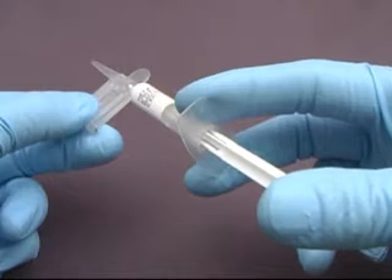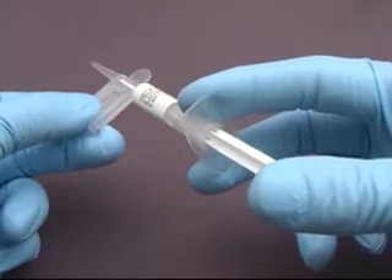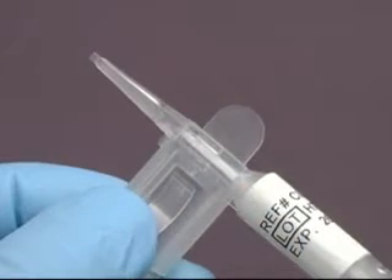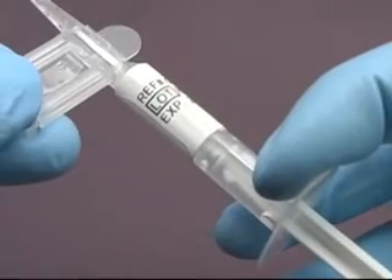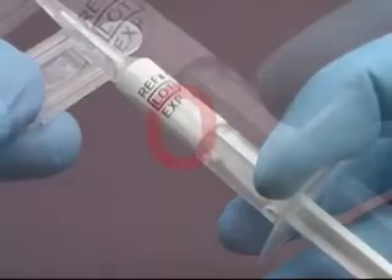Now slowly advance the plunger, which will move the CrystalLens forward and up into the tip of the CrystalCert. Then stop when the plunger hits the forward detent position as shown here.